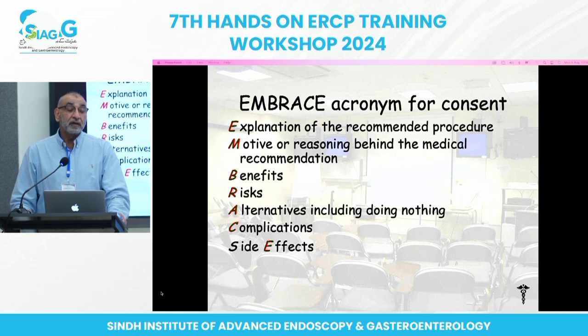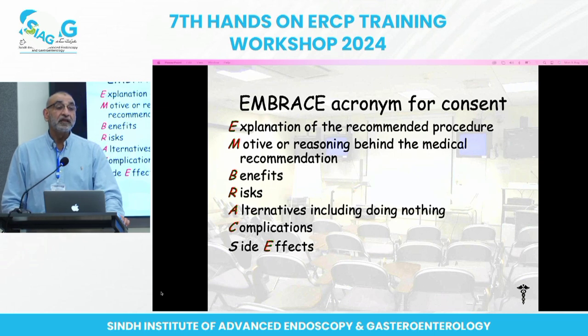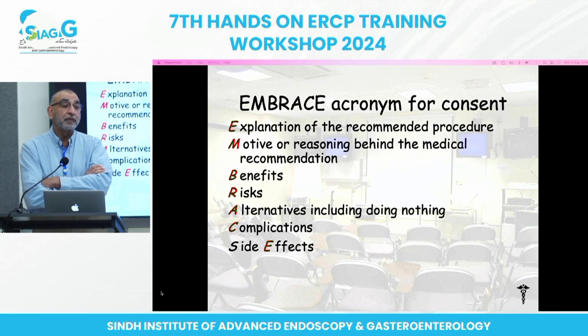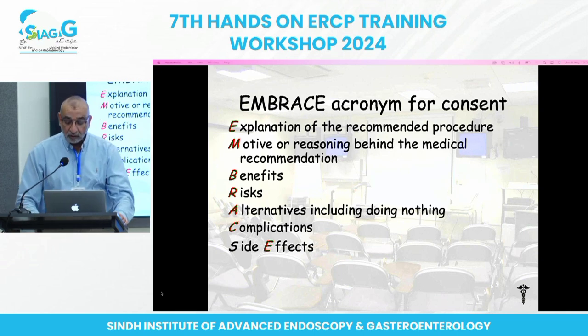Somebody who's got a rip-roaring cholangitis, there's not much of an alternative there, unfortunately, because you need a therapeutic procedure there. Complications, and then the side effects are effects of any medication that you use. Because when you are using conscious sedation or a general anesthesia or propofol anesthesia, you are exposing the patient to risk of those medications. Even when you use pharyngeal spray with lignocaine, some people are allergic to that and they might have an anaphylactic reaction.